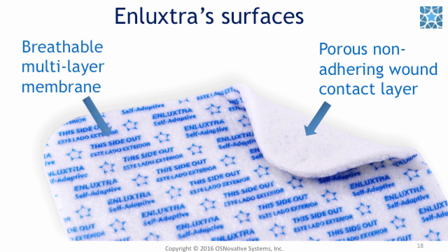The other side is a breathable backing film, permeable to water vapors, but impermeable to fluids and microorganisms. It also serves as a strike-through barrier and protects from harmful bacteria.